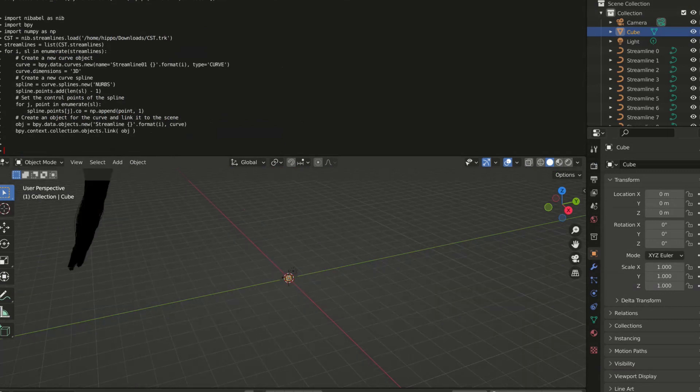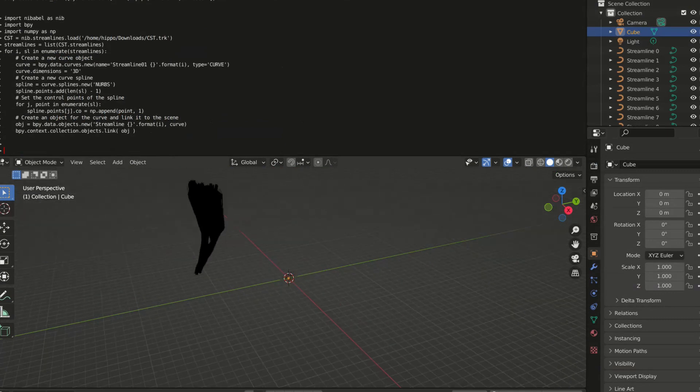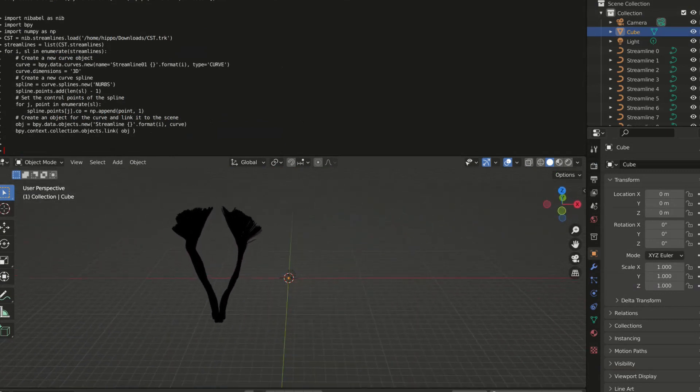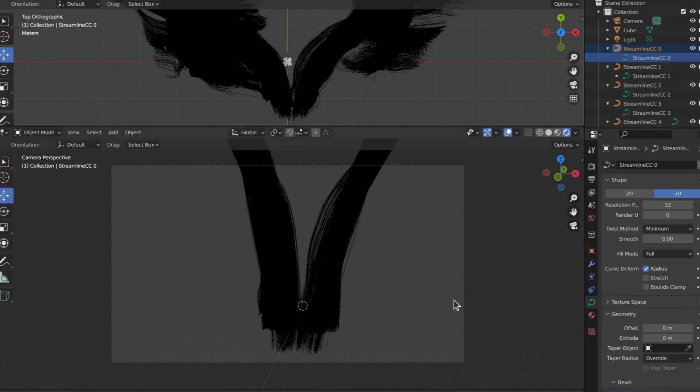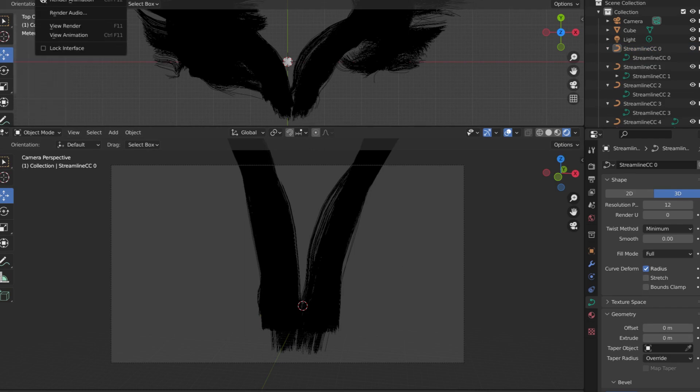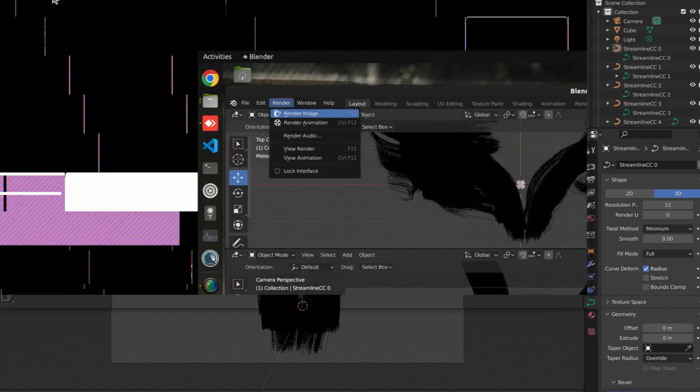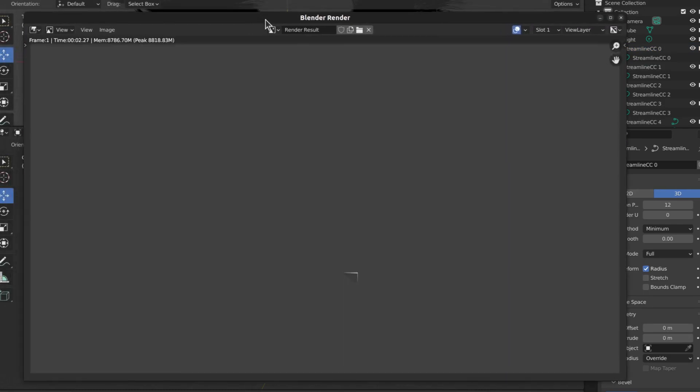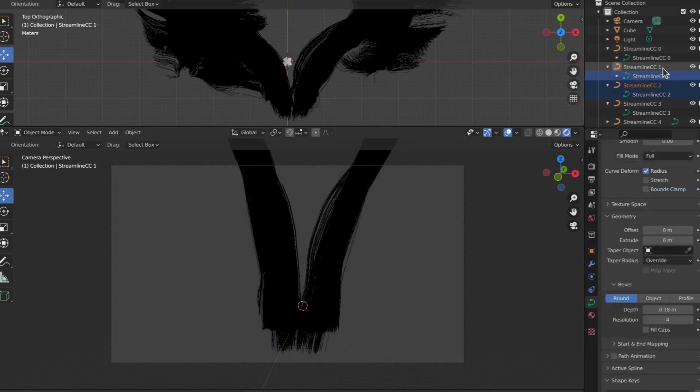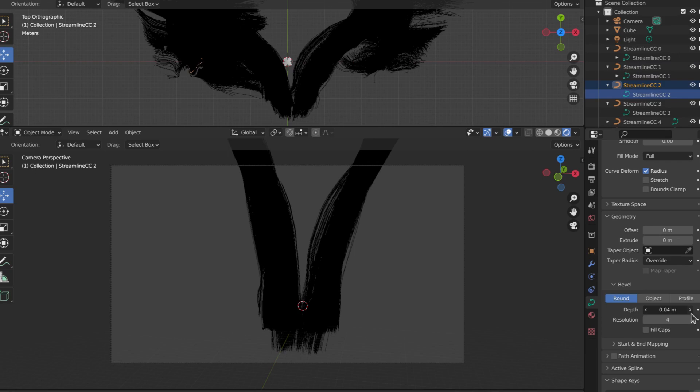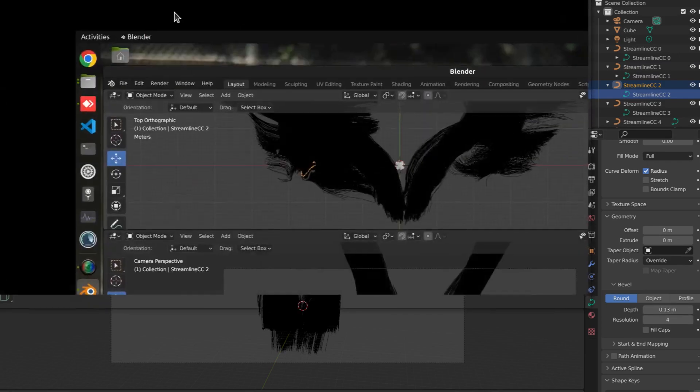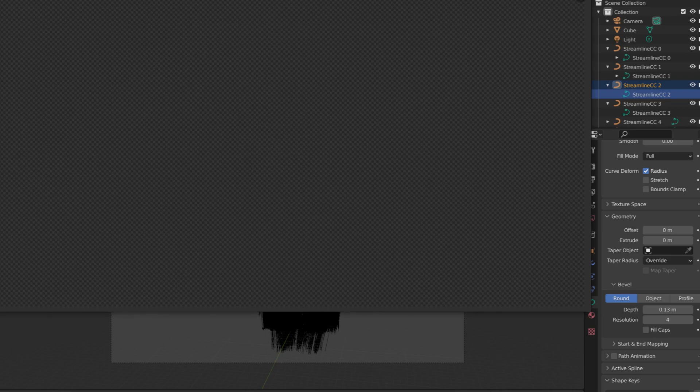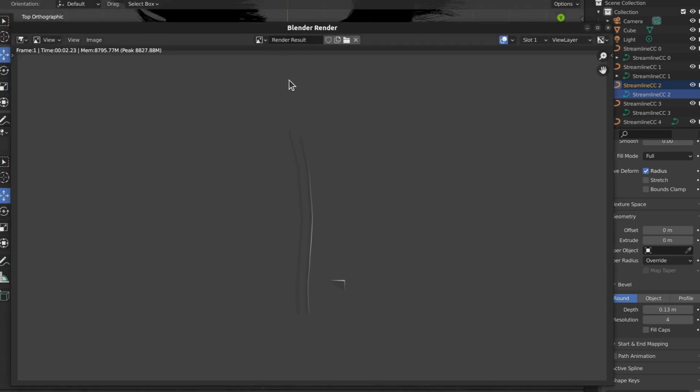The issue with NURBS is that they're just streamlines still. They are not yet a mesh or some kind of triangular structure. So what you have to do is generally you extrude them or in this case a simple thing can be just to add some bevel around the streamlines. For example like this. And now I saw only for a couple of these streamlines not the entire fiber bundles of the corticospinal tract and you can see already that if I do the rendering now they are visible.